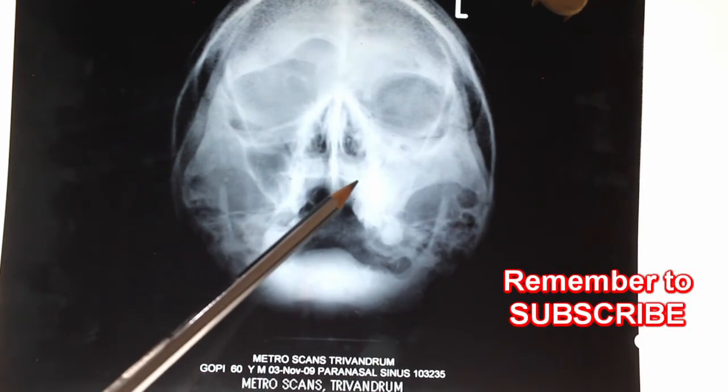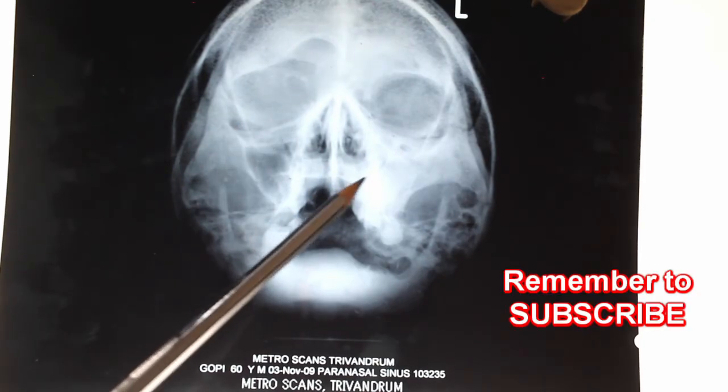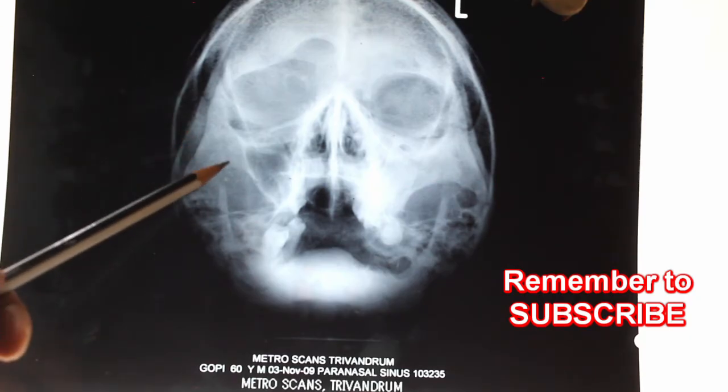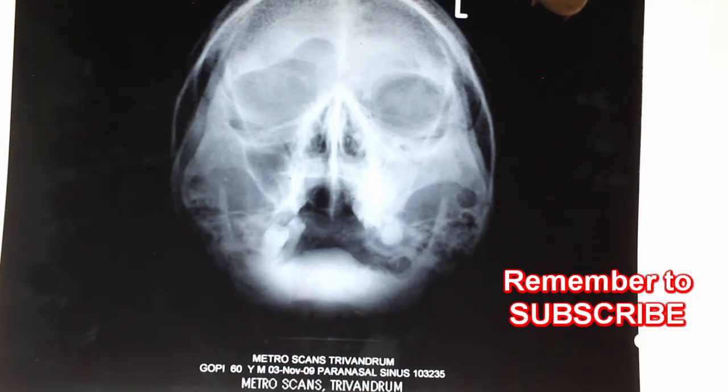Tell the findings in the X-ray. That will be a better way than giving a diagnosis. And the diagnosis should always correlate the X-ray finding with the clinical finding. Then only you can give a correct diagnosis.